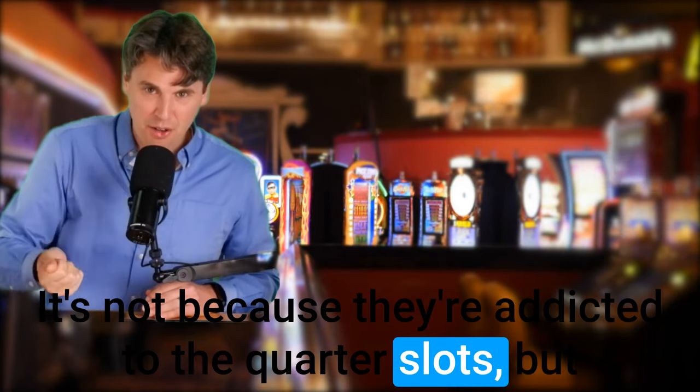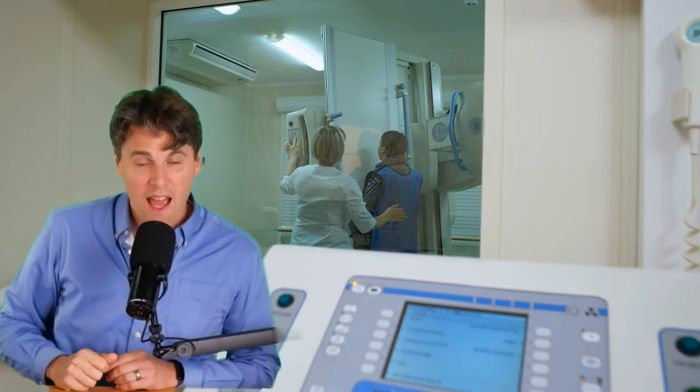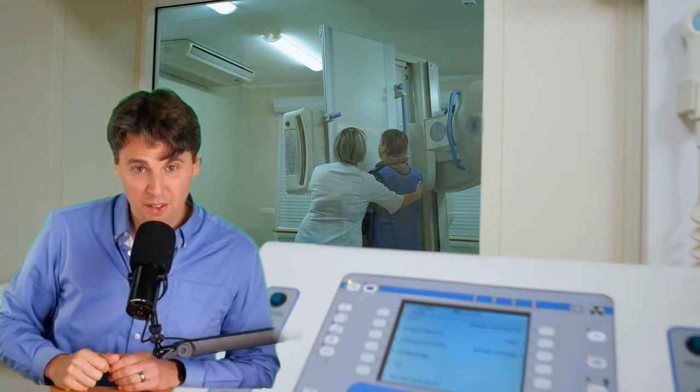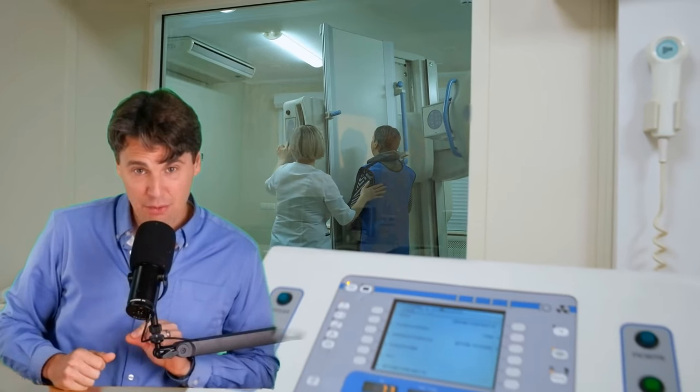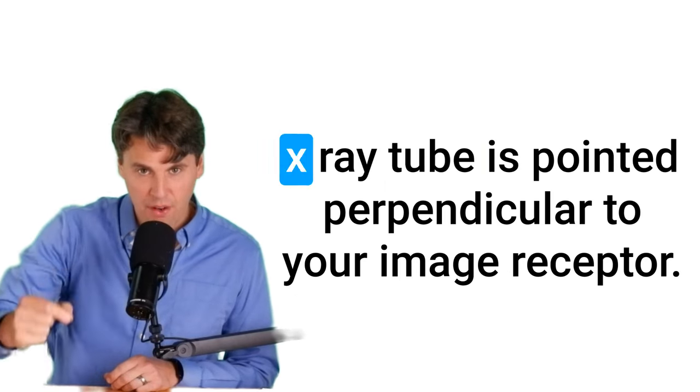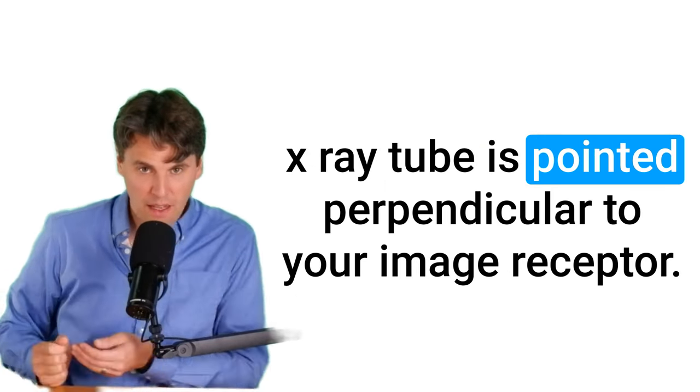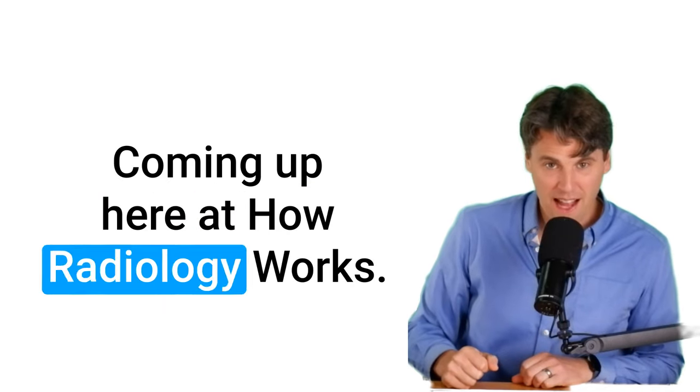It's not because they're addicted to the quarter slots, but rather they want a good way to figure out how your light field on your x-ray tube actually matches to the x-ray field itself, as well as how can you make sure that the iso-ray of your x-ray tube is pointed perpendicular to your image receptor. Coming up here at how radiology works.